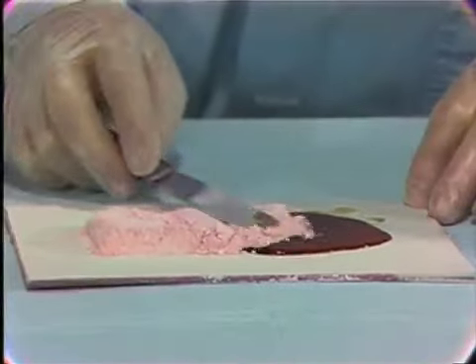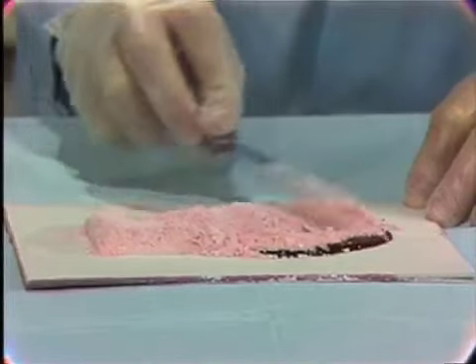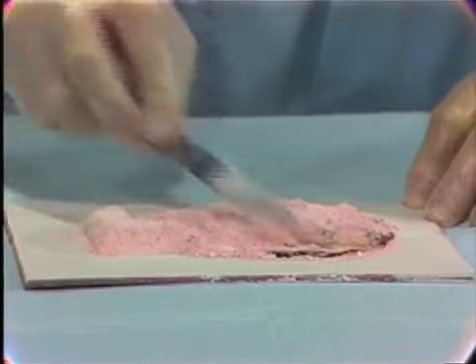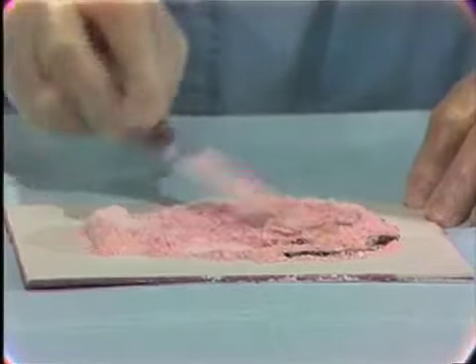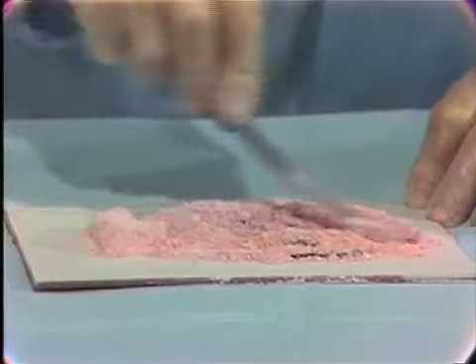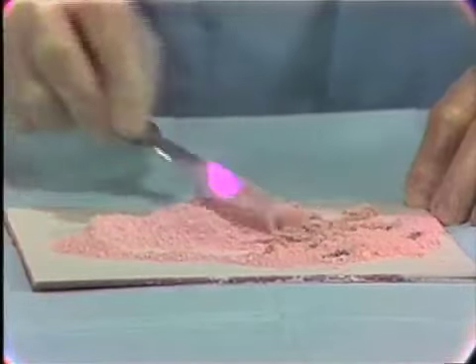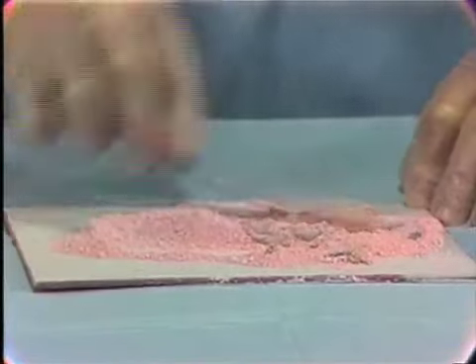The first part of the procedure, we try to incorporate as much powder as we can into the liquid. As you can see, it's difficult to get the powder to go into the liquid, so it's merely a smashing procedure at the time. First, get as much powder as you can into the liquid.